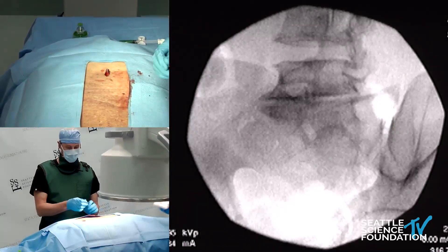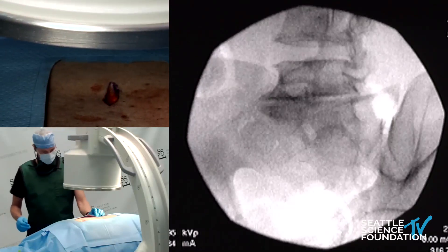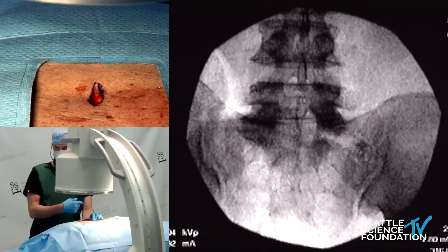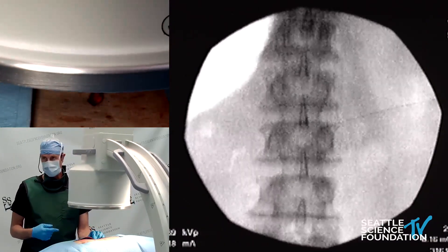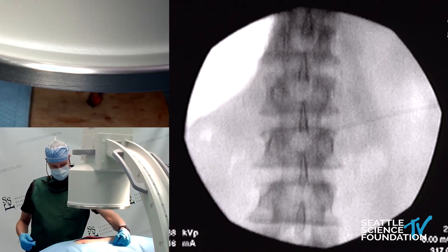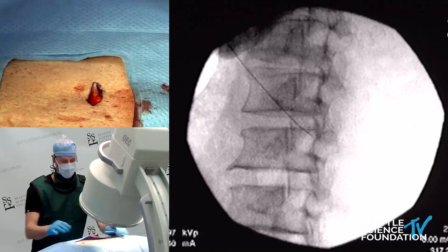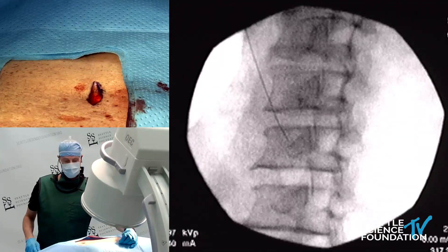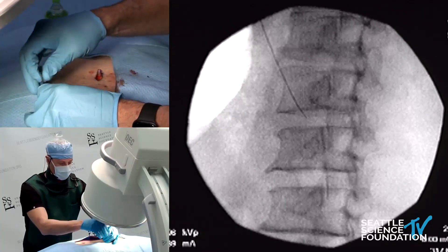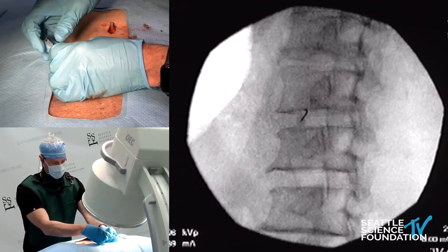I have a little bend on my needle to exaggerate the steering capability. We'll pick this disk — arc about 30 degrees toward you. The goal is simple disc access, the same as with discography. We place the 22-gauge needle directly into the disc.